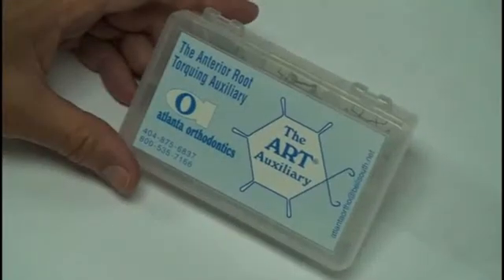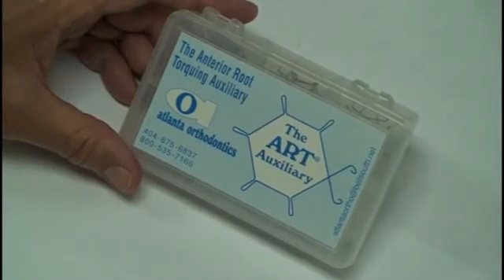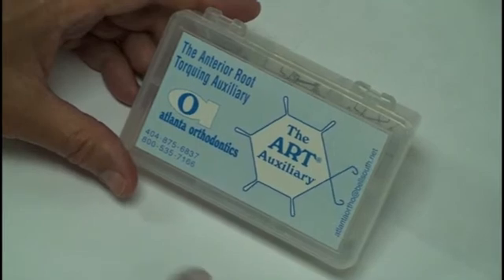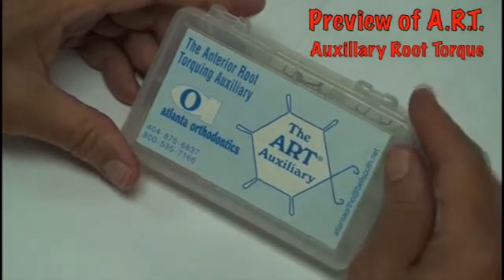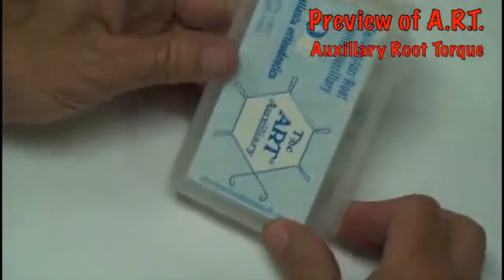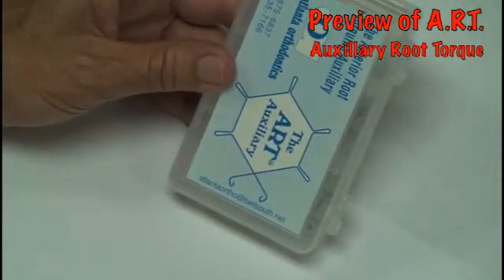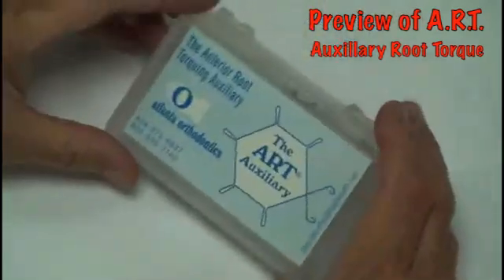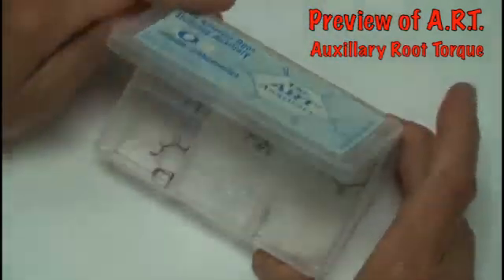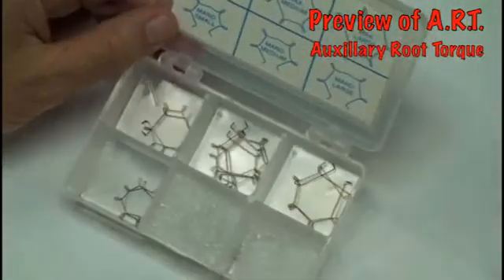This is the Anterior Root Torquing Auxiliary Kit, which comes from Atlanta Orthodontics. You can contact them at their email address, atlantaortho at bellsouth.net.